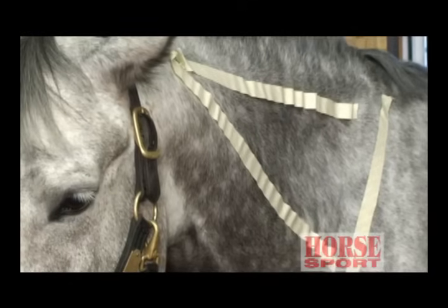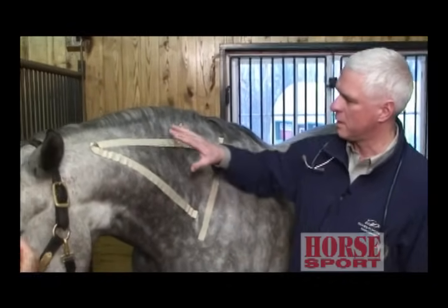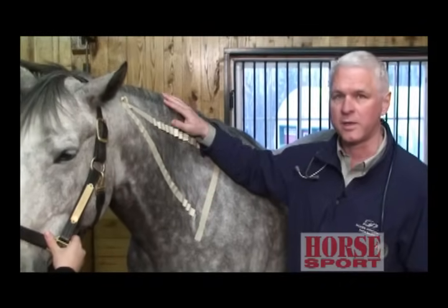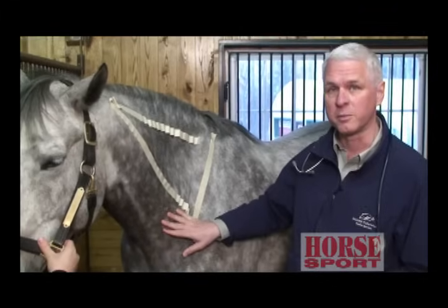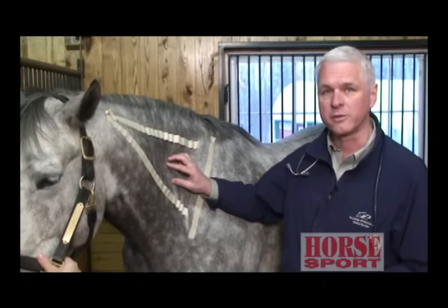There are a couple of areas that we recommend, primarily giving it in the neck area, but we'll also talk about giving it in the hindquarters and in the pectoral muscles. When we're giving an injection in the horse's neck, we want to focus on this area. The tape on the horse shows areas we don't want to hit with the needle. Up here is the nuchal ligament that attaches to the withers to the back of the head. Down here is the cervical spine — there's bone here — and right here is the shoulder. So this area has deep muscle where the medication can go in and get distributed to the rest of the body.